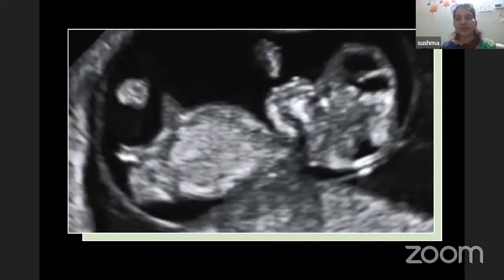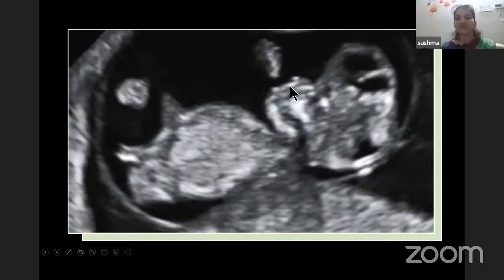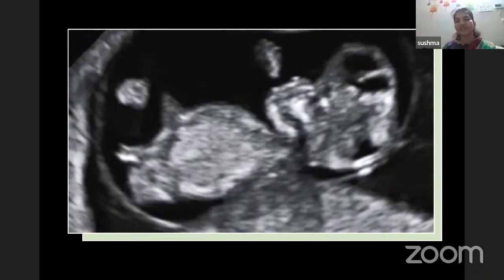How many answers did we get, Dr. Monica? No, ma'am, we didn't get any answers yet. Okay, we'll wait for a few more seconds. This is a very simple and straightforward diagnosis. This is a first trimester fetus at the time of NT scan, or even prior, at around 11 weeks, right? We got 3 answers, ma'am. Okay, we'll wait for a few more seconds. We want more people to attempt. Whatever you are thinking, please post it.